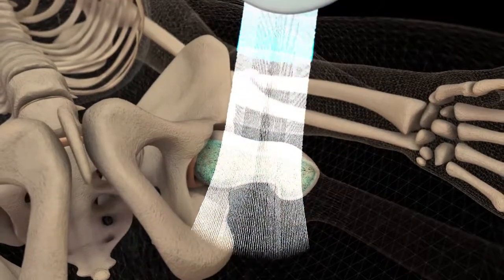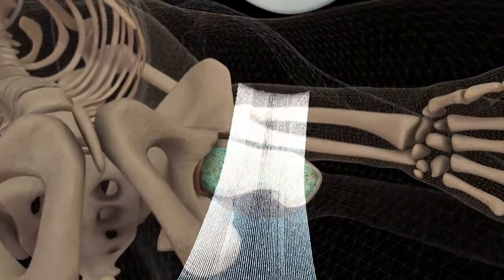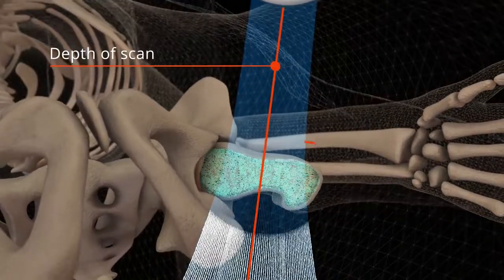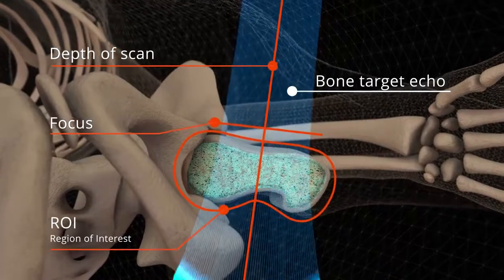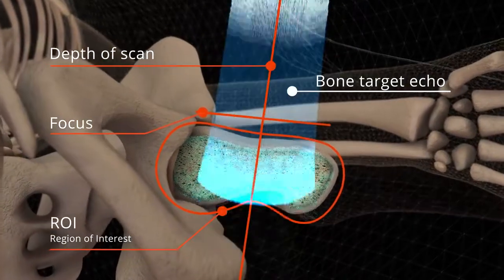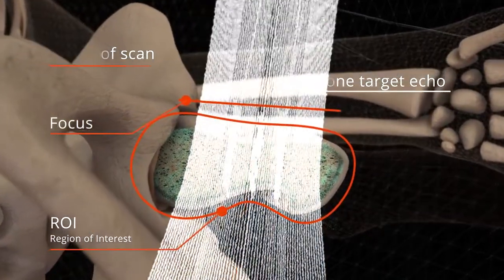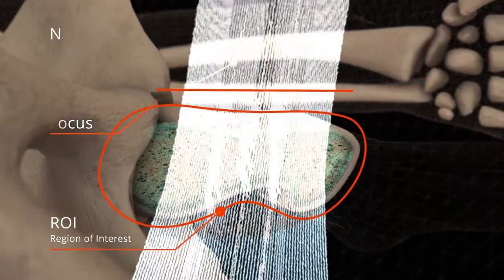During an ecographic scan, the operator sets focus and depth in order to visualize the bone targets in the middle of the ecographic field of view. The software automatically detects the bone interfaces and allows the identification of the region of interest.